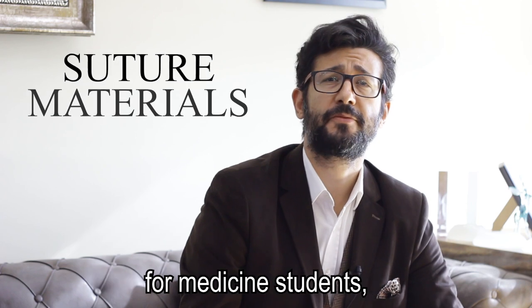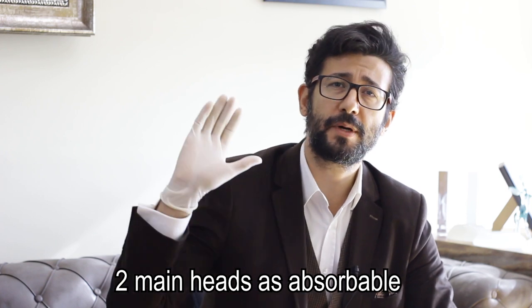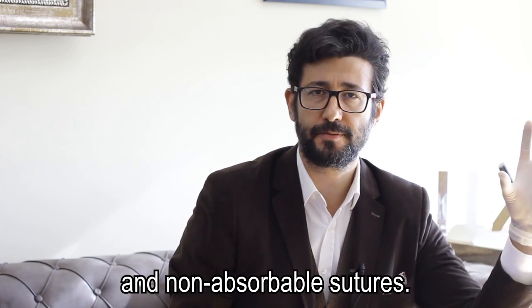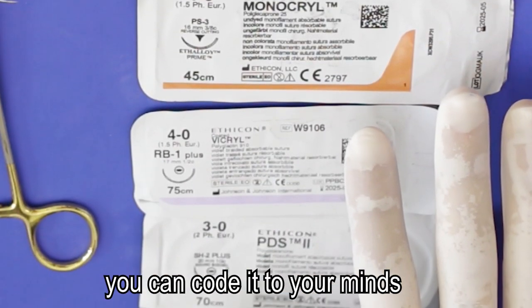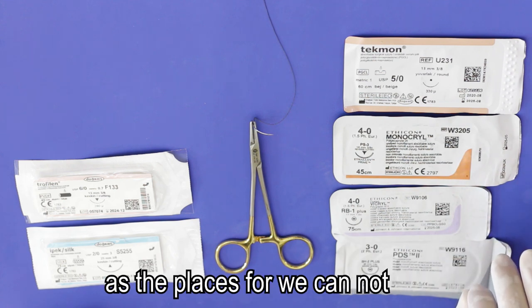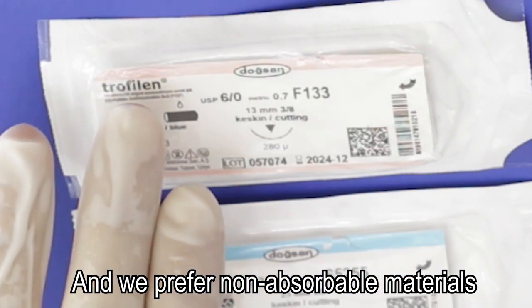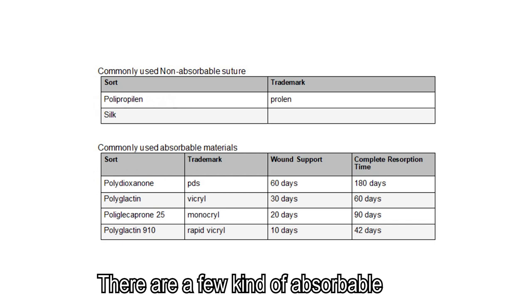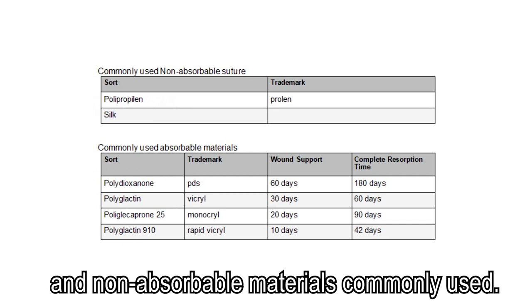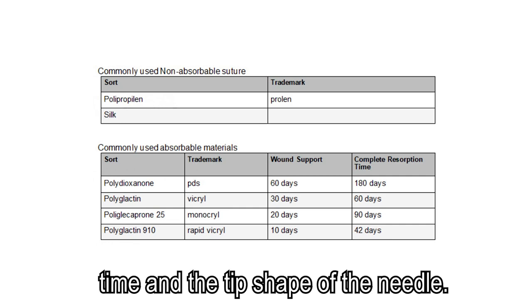Although it seems so fuzzy for medical students, suture materials can be collected under two main heads as absorbable and non-absorbable sutures. We prefer absorbable materials for subskin closure, and you can code it in your minds as a place where we cannot remove the stitches. And we prefer non-absorbable materials for skin closure and tension closure. There are a few kinds of absorbable and non-absorbable materials commonly used. In essence, they differ according to their absorption time and the tip shape of the needle.